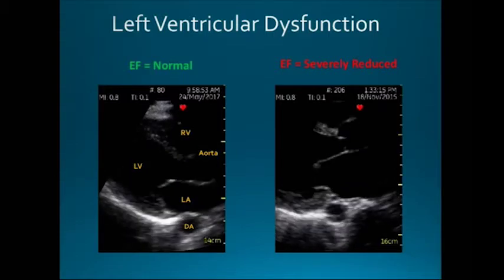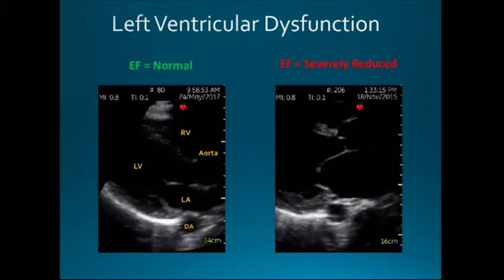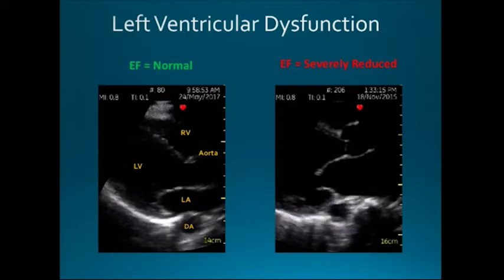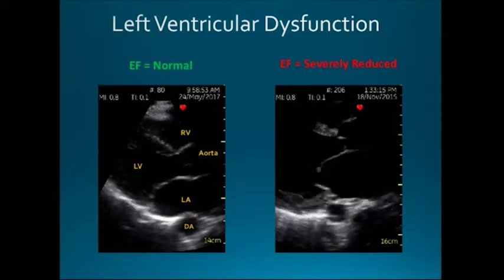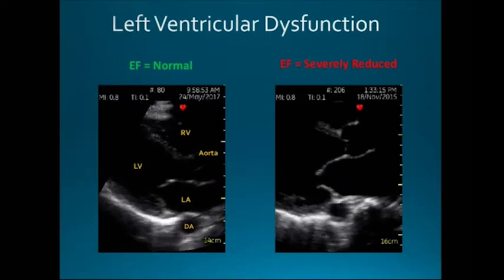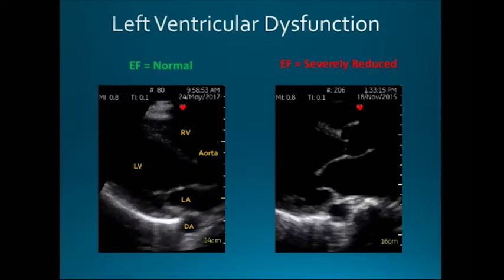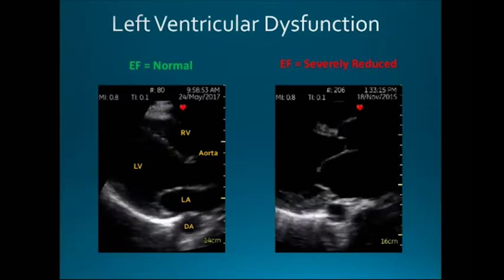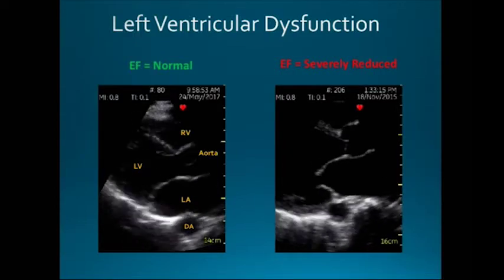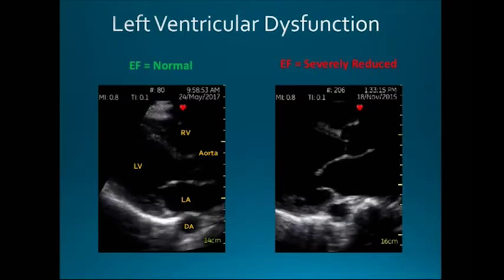When people have severe left ventricular dysfunction, the LV chamber here dilates, and it stretches this distance from the anterior leaflet of the mitral valve from the interventricular septum. And this valve here almost looks like it's stenotic, right? It almost looks like it's just kind of barely, what I like to call burping open. It's just barely moving at all. And this distance here, you can use a 1 centimeter cutoff as your normal from abnormal. And this is a 1 centimeter hash mark.